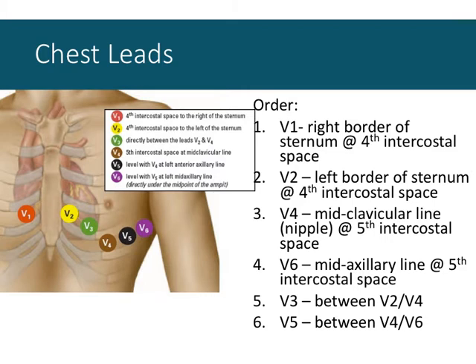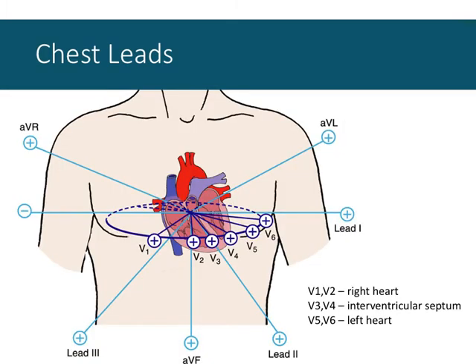And I'll show you what the combined 12-lead ECG readings would look like. Not the readings, but the vectors, the leads. All put together, we get this complicated, detailed view of the electrical activity in the heart. So I have lead 1, horizontal, lead 3, slightly angled to the right, lead 2, which is our classic lead, the augmented voltage leads, which are halfway between those, and for complexity's sake, thankfully, this diagram doesn't extend them all the way through. And then the 3D oval in the middle is meant to represent the horizontal plane, V1 through V6.